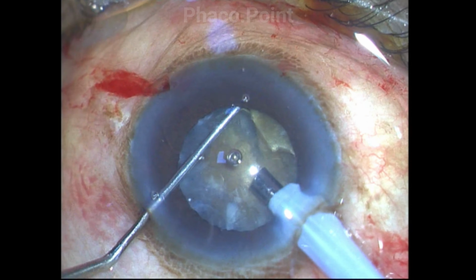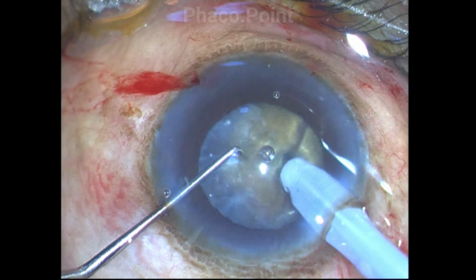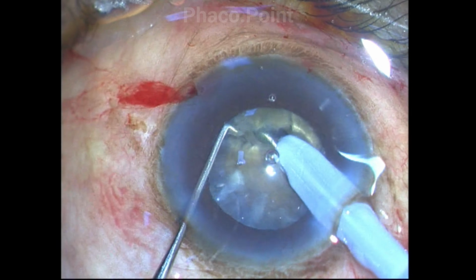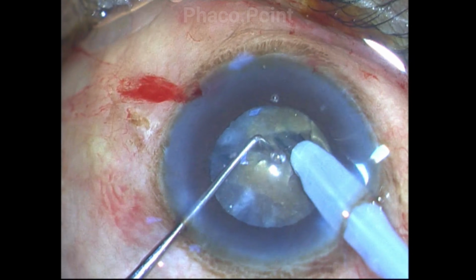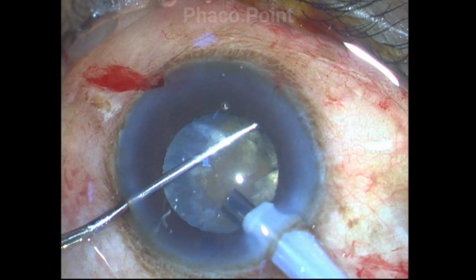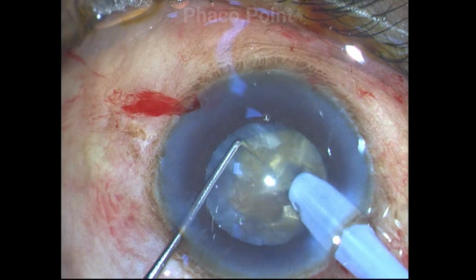The nucleus is now rotated and you've got one half of the heminucleus, which is now further chopped. So the surgeon buries into the nucleus once more, a lot more than you would into a soft cataract, and chops. Again, he takes his time to confirm that the break in the nucleus includes the posterior plate. This fragment itself seems to be quite big. The surgeon now chooses to rotate again and this fragment is further chopped into a smaller emulsifiable fragment as demonstrated.